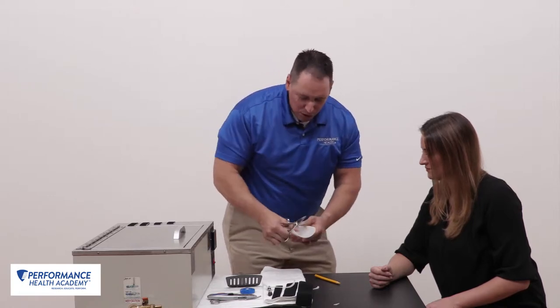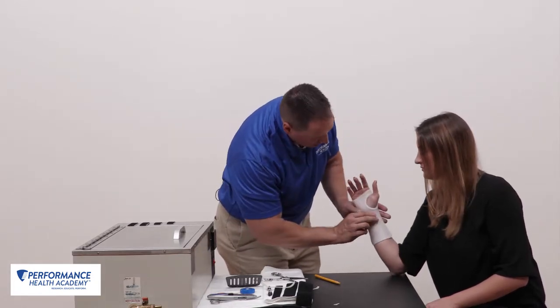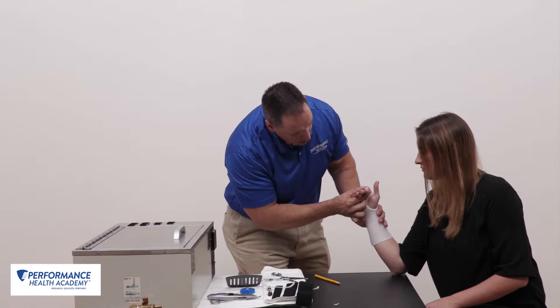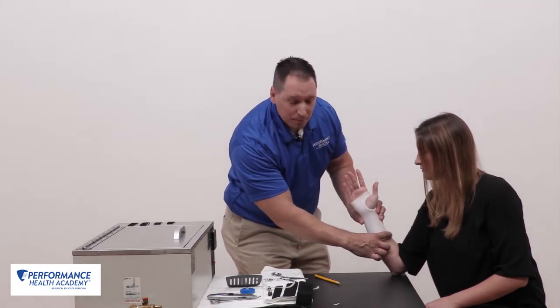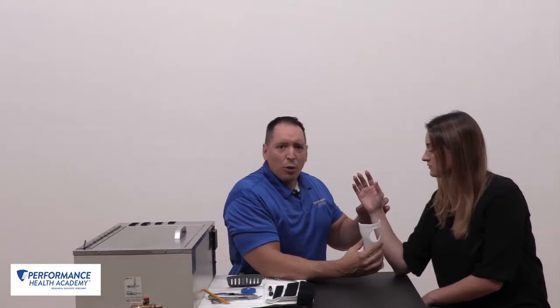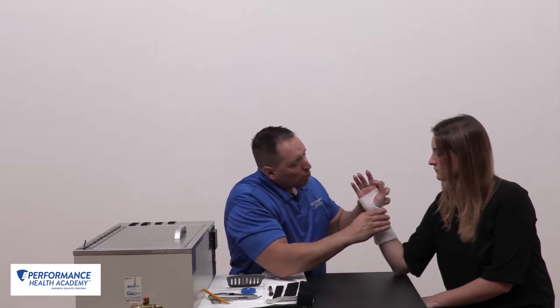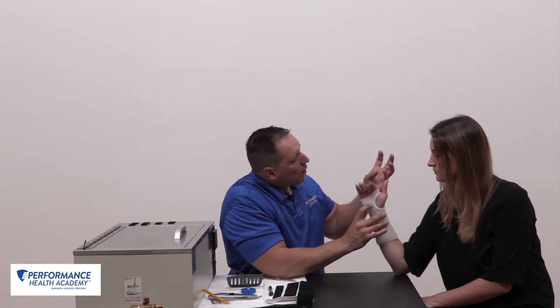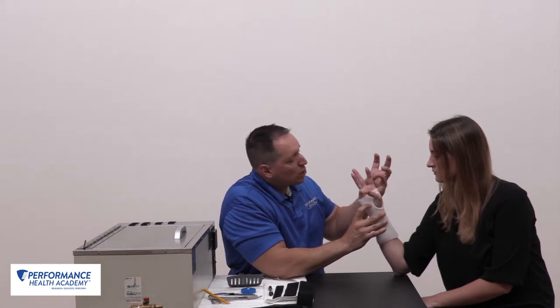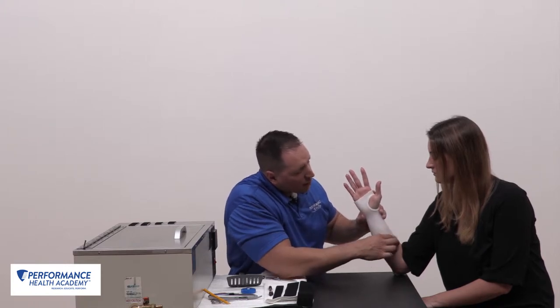I always round my corners. Now I'm going to reapply the orthosis to make sure the MCPs have good motion, then apply my strapping. When you reapply, frequently check and recheck to make sure it's a comfortable fit. We'll reapply to make sure there's unimpeded MCP motion and that the patient can function within the orthosis. Can you touch your small finger? And that should be a good amount for daily function.